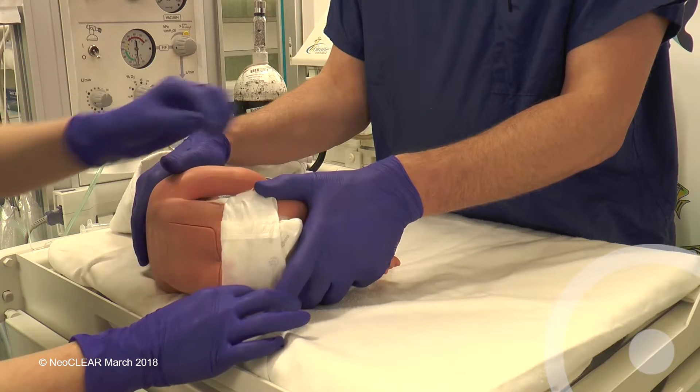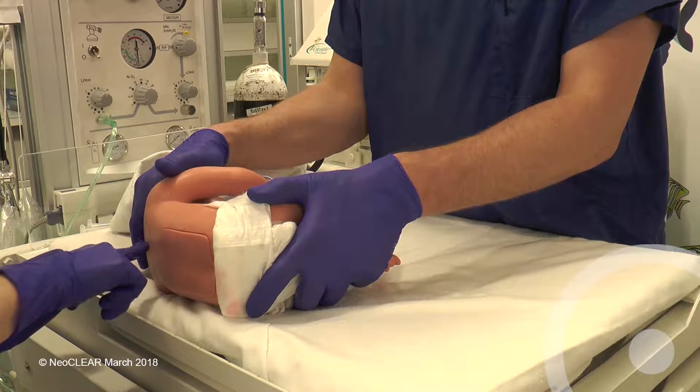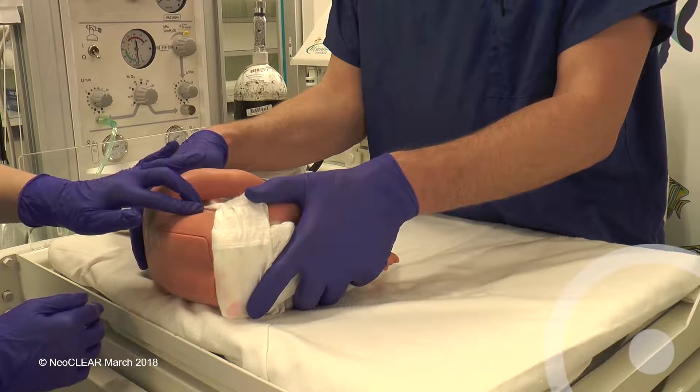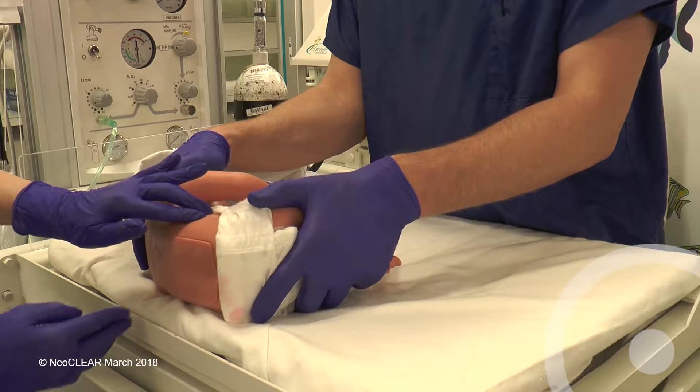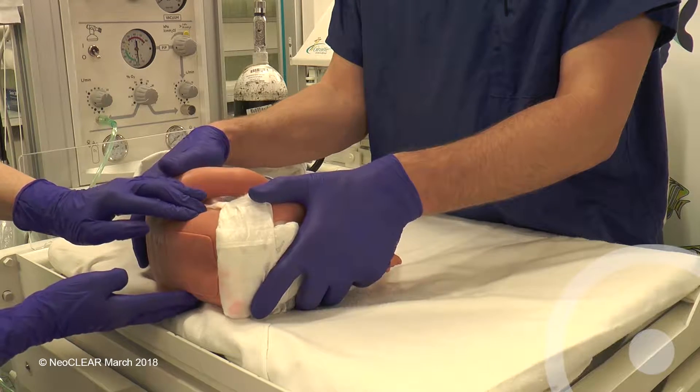For a lying lumbar puncture, the infant should be held on their side, usually their left, with the spine straight and parallel to the bed. The knees and hips should be flexed as much as possible. The hips and shoulders should be held firmly, but do not over-flex the neck.